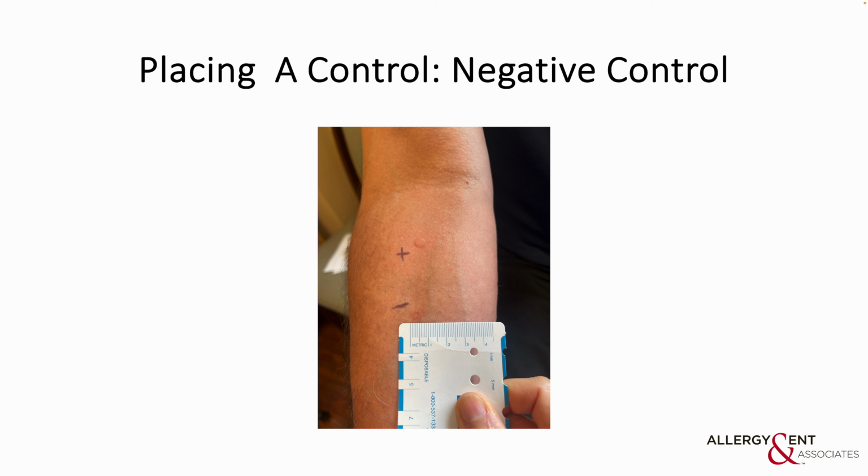From the above mechanisms, we learned that the presence or absence of histamine is important in skin test reading. Therefore, we do a positive and a negative control, so that we can read the result correctly. If the patient takes some type of antihistamine, the positive control will be negative and the entire test will be completely invalid. This is a positive control, which is histamine you place on the patient's skin, and this is the negative control, which is water.